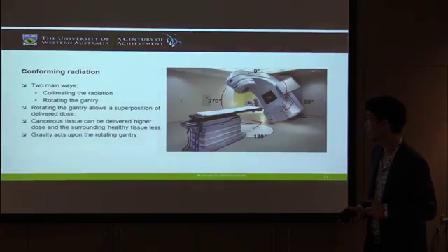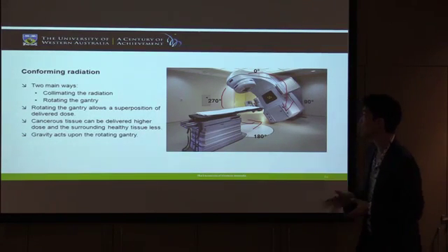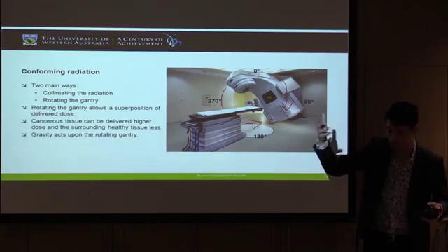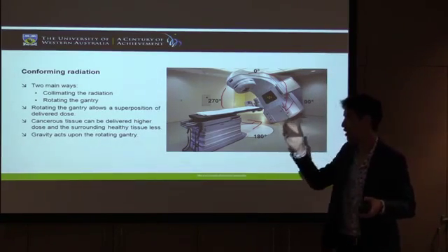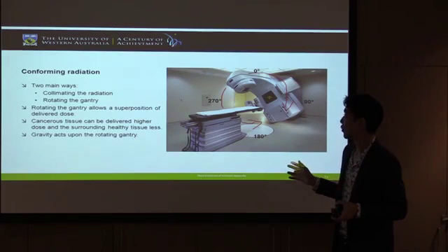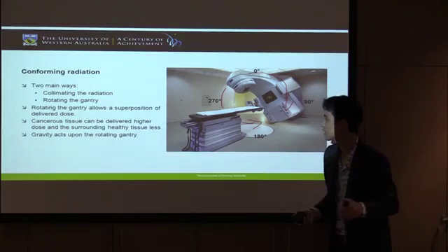I should also say that gravity, the ever-present force, also does affect the gantry. It makes the gantry sag by like a centimeter or a millimeter. There's been papers done and whatnot. So that's a seed for later. I'm going to come back. I'm planting seeds. It's great.